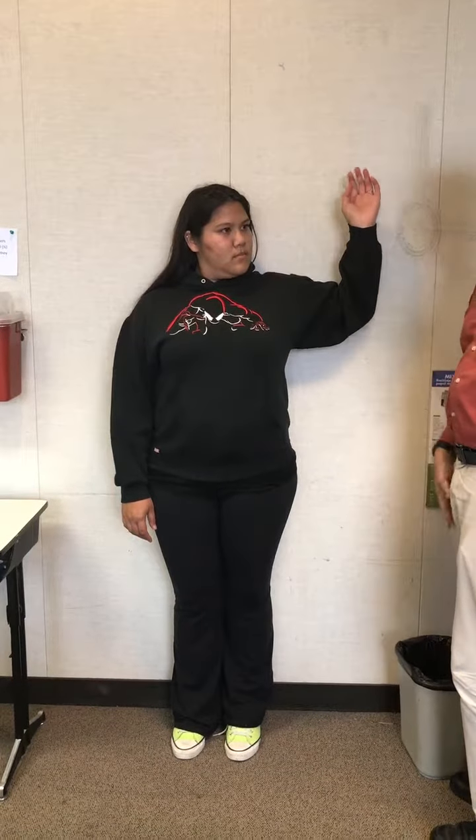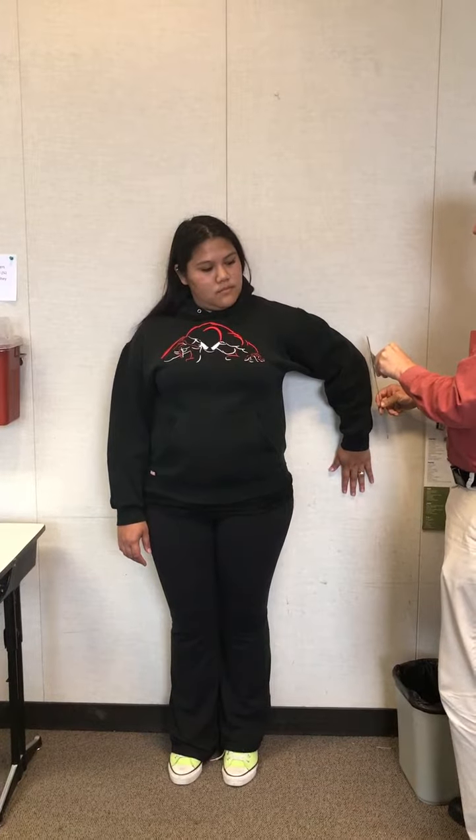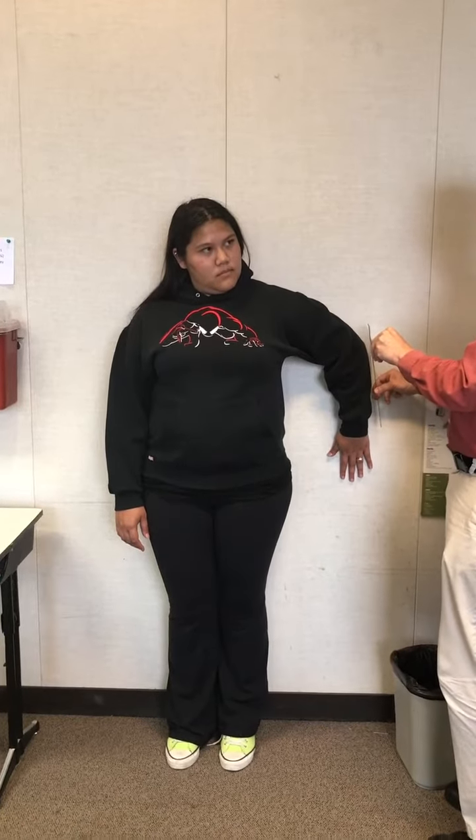So normally, about 90 degrees. Now go in the other direction. It looks like it's 90 degrees of internal rotation.